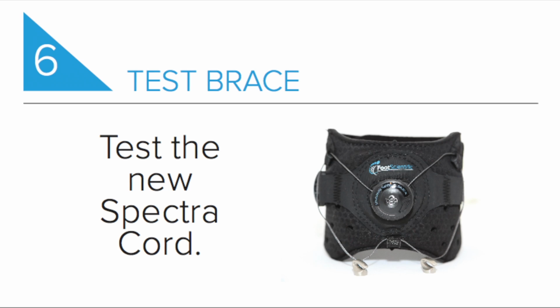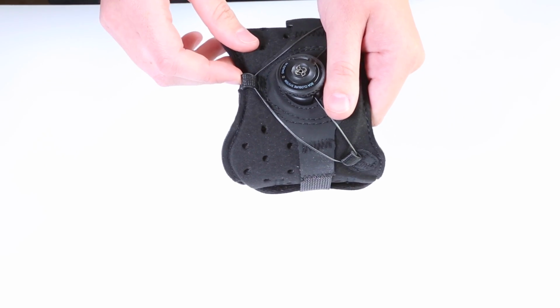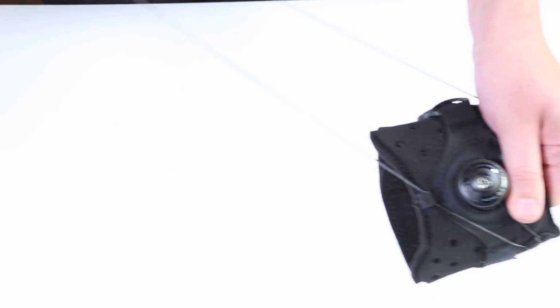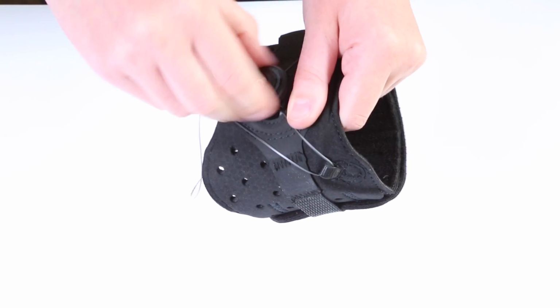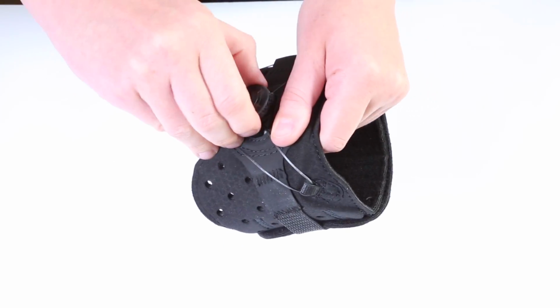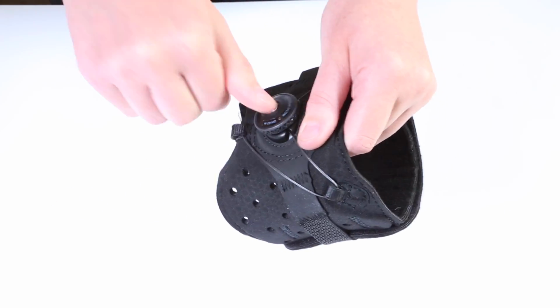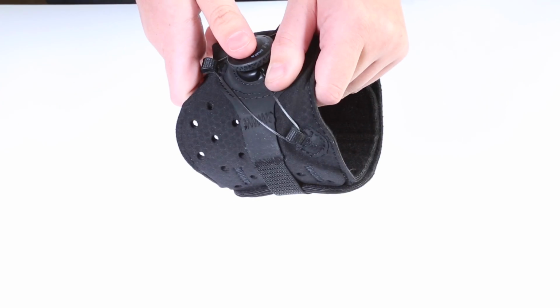Step 6. The last step is to test the brace. You really want to test your cord to make sure that you've done it properly before you actually put your brace on. So I'm going to take and pull it a couple times just to make sure that that cord is working properly. It seems that the Spectra cord is pulling. There's no tangles, there's nothing wrong with it. So I'm ready to put it on and go.